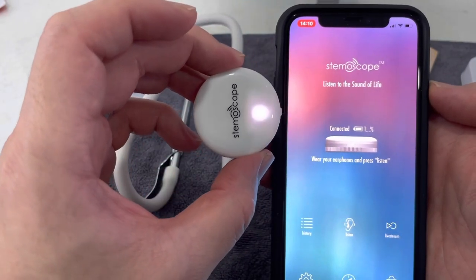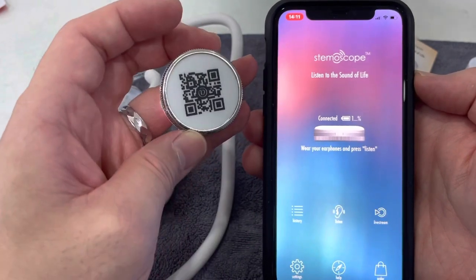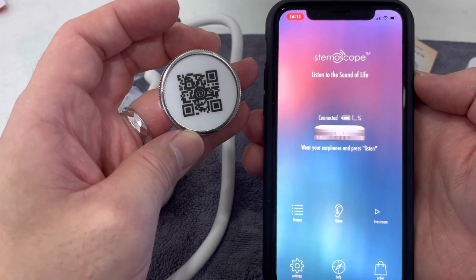A little light appears and that should connect - it's connected. Then you can wear your earphones and press listen.